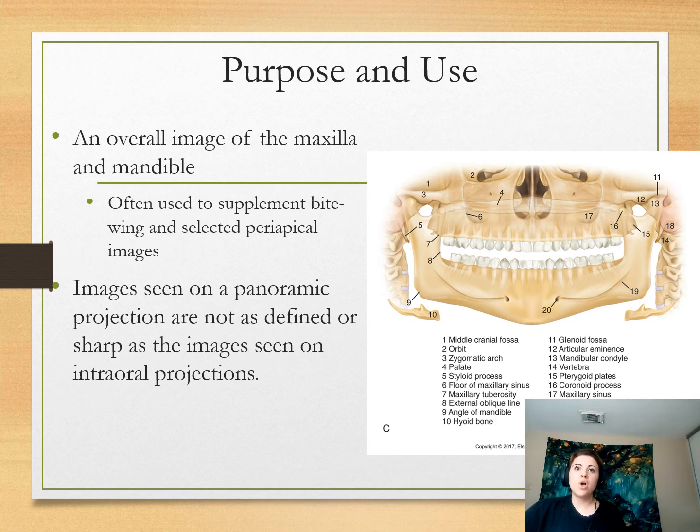It was so pervasive that it's not something that we were capturing with bitewings. If we had only taken bitewings on him, we would have never known. If we had only taken those PAs, we would have probably questioned it, but we wouldn't have known what it was. And then when we took our panoramic, we were able to figure out, hey, you have a pretty big problem here. You need to go to an oral surgeon.